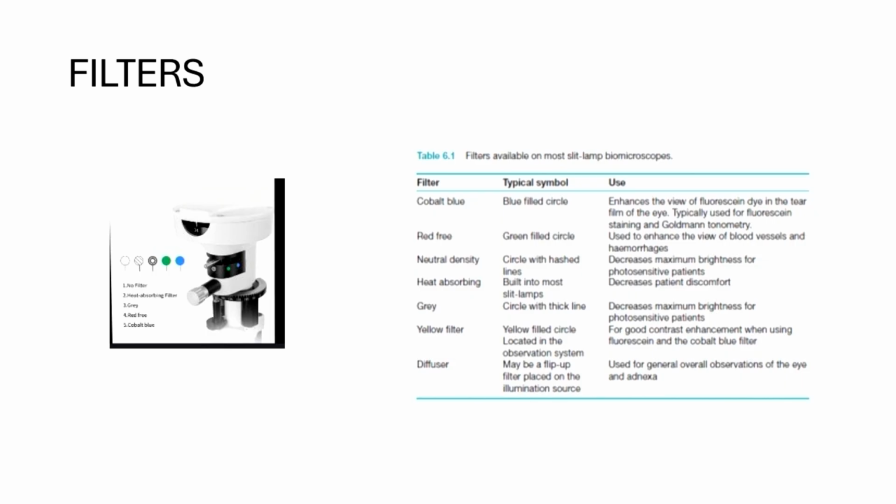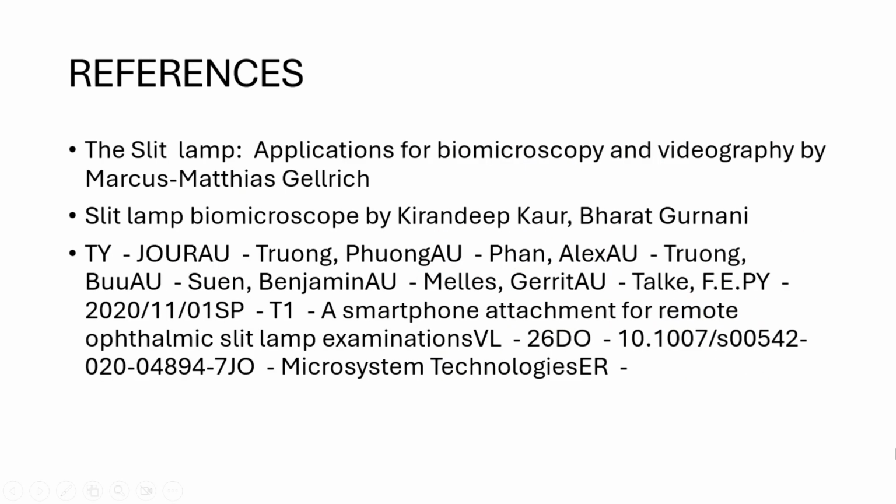Diffuser, it may be a flip-up filter placed on the illumination source. As in the slit lamp photos we have taken, we use the diffuser for general overall observation of the eye and adnexa. These are my references.